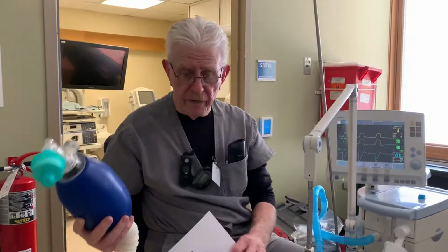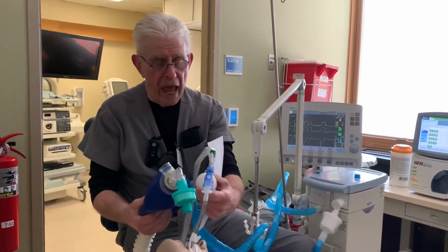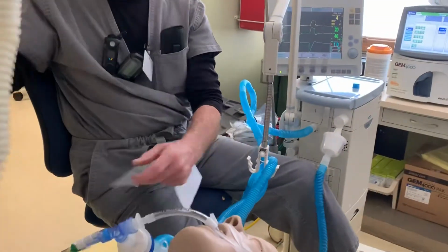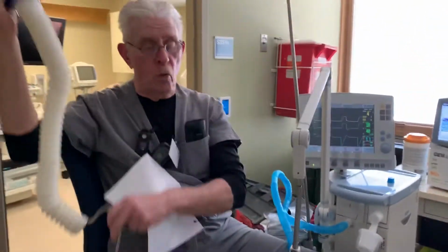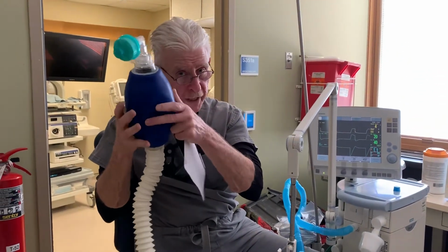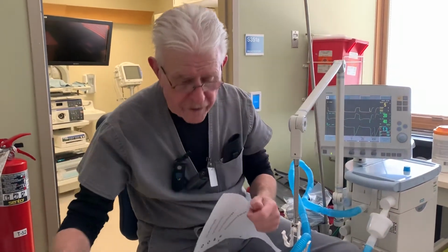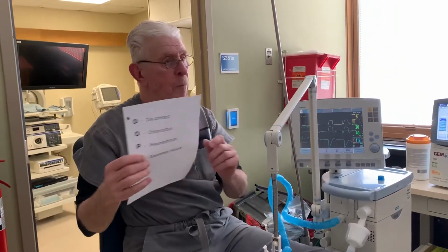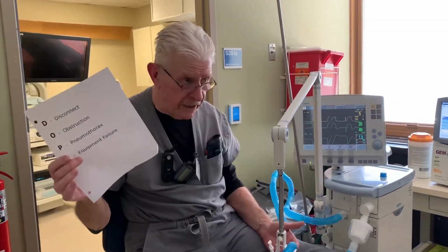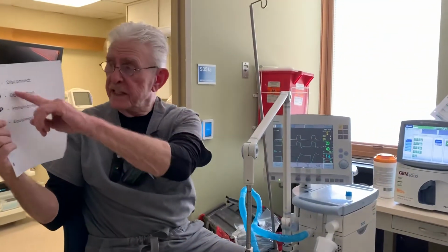So, should you have an alarm and it's continuous, you would take your bag and provide support to this patient, and hopefully remember to connect the oxygen up to the wall, turn the flow meter on, and then 1, 2, 3, squeeze. 1, 2, 3, squeeze. All right, and then hopefully somebody's going to come along and look to see, is something disconnected? Or is something wrong with your endotracheal tube? So is there a disconnect?